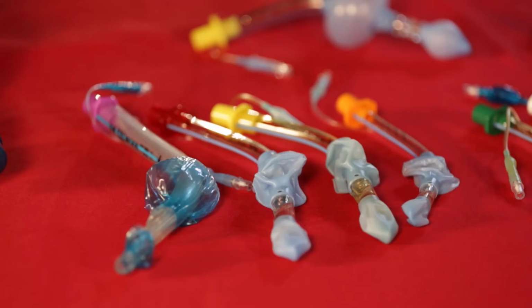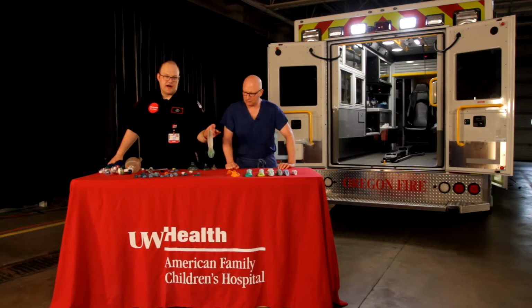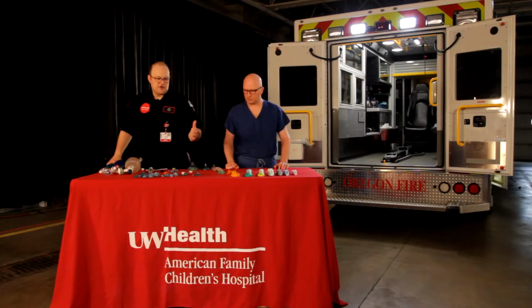So if you notice, there's a lot of colors that are similar, but their sizes are not the same. So for example, the size 5, or the largest size of i-gels that I have here, would correspond to one of the mid-range 2.5s in the King tube. So just make sure that you know whatever you have and how to size them.